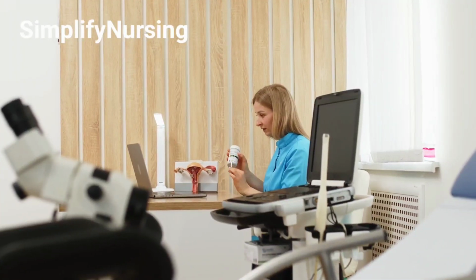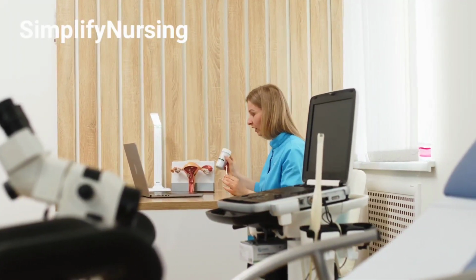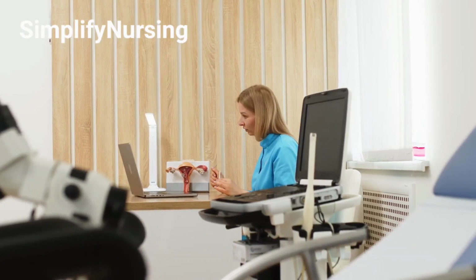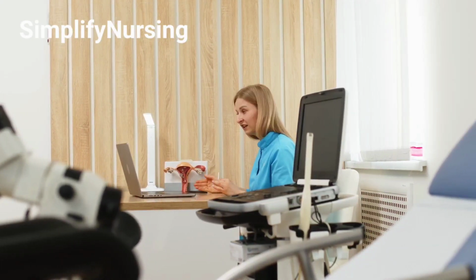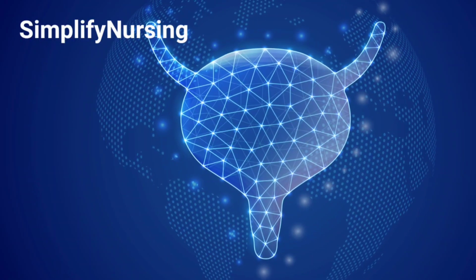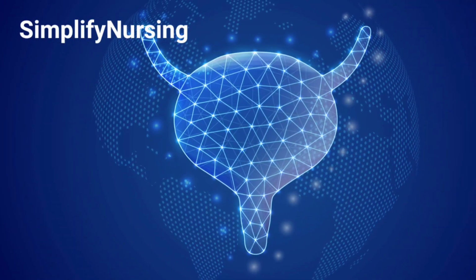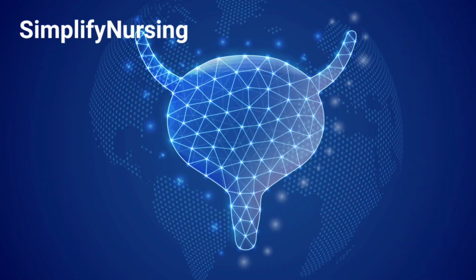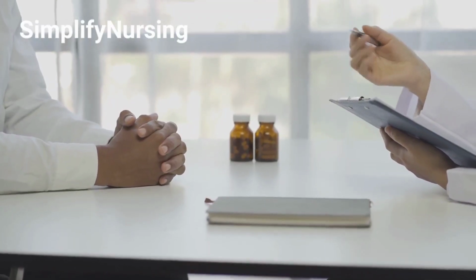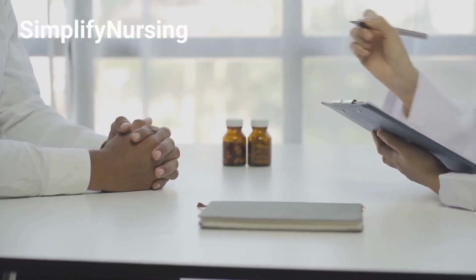During the procedure, the healthcare provider will cleanse the genital area, possibly apply a local anesthetic, and gently insert the cystoscope through the urethra into the bladder. They might use saline or sterile water to fill the bladder for better visualization, then examine the bladder and urethra, taking biopsies or performing necessary interventions. Post-procedure, monitoring for complications and giving recovery instructions is key.